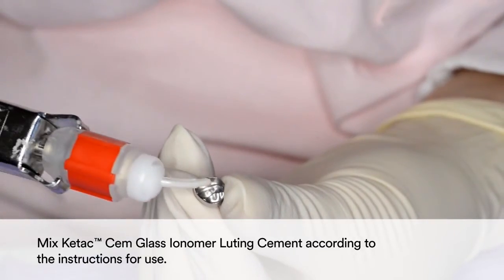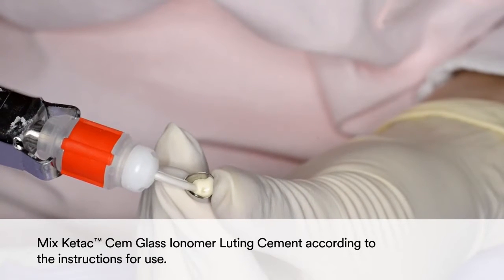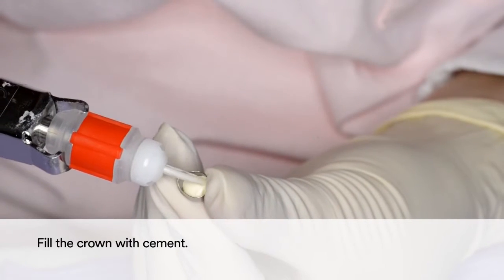For cementation, mix Ketac Cem glass ionomer luting cement according to the instructions for use. Fill the crown with cement.